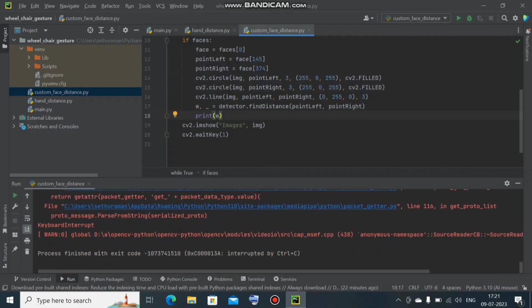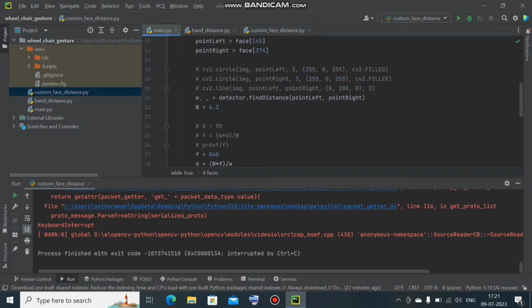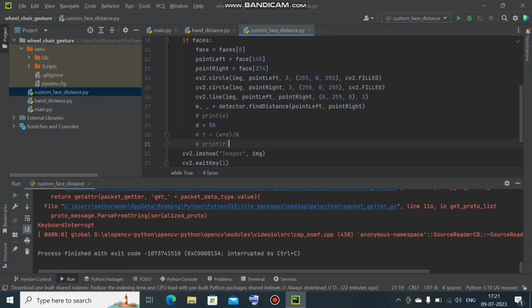As the next step, let us comment it out and find the focal length. For finding focal length, I have the formula from before. d is nothing but distance. What we need to do is sit at a 50 centimeter distance from our webcam. I take my steel scale or a tape and measure 50 centimeter accurately from my webcam, and I am sitting there. So f is equal to small w, the distance between these two points, times D, the distance, divided by capital W, which is the object. Here our object is our eye. For males it is around 6.4, and for females it is around 6.2, so 6.3 is the in-between value.